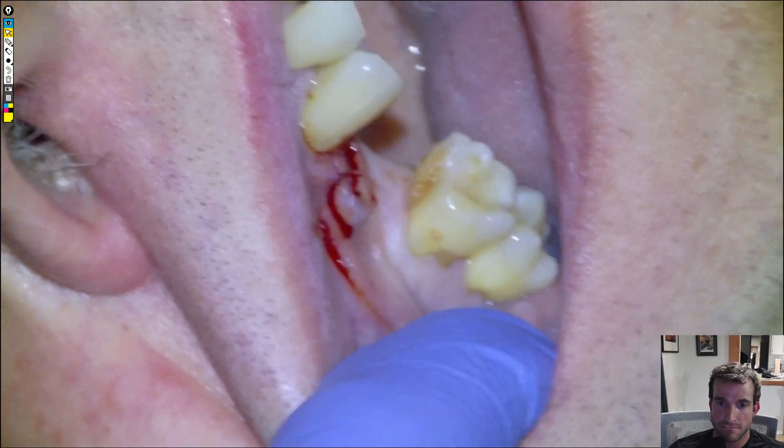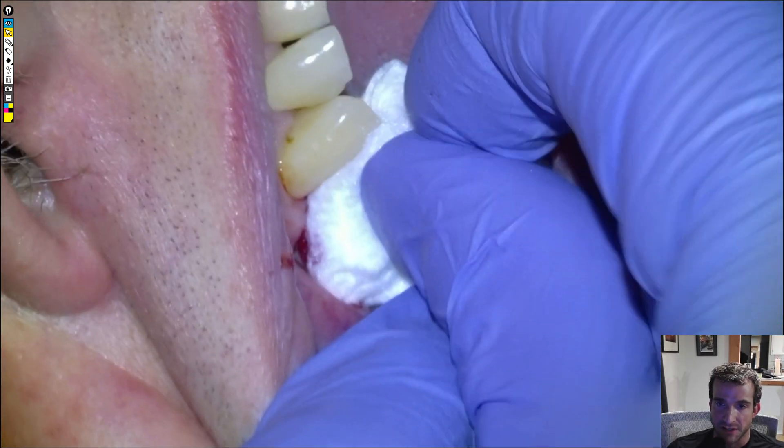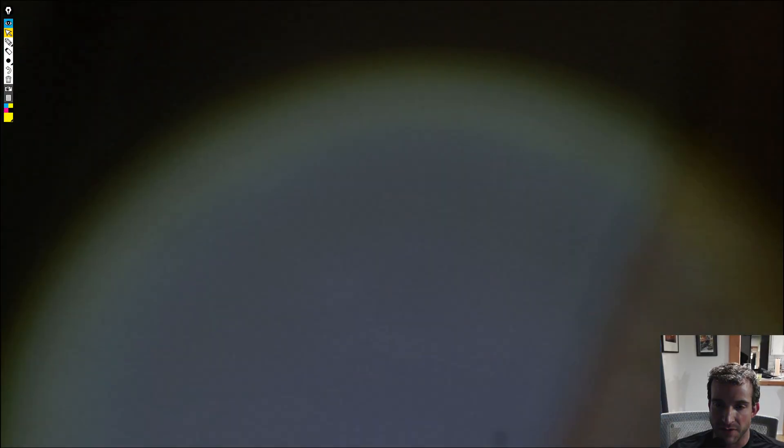We don't need to suture it because there wasn't any lesion. You can bite down and you're free to go. Have you taken any Advil or Tylenol? No. I'll send him home with a bunch of Advil and Tylenol — it's going to heal up just fine. I think we're going to do either an implant or a bridge in there at some point, whatever he wants.